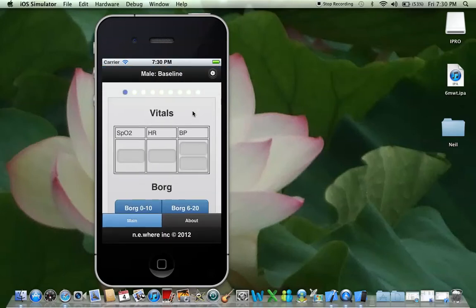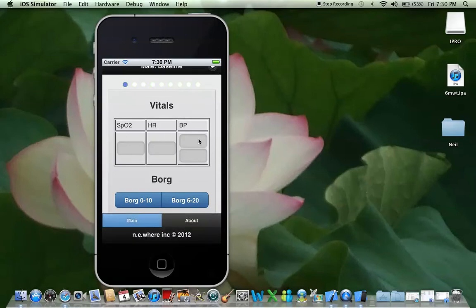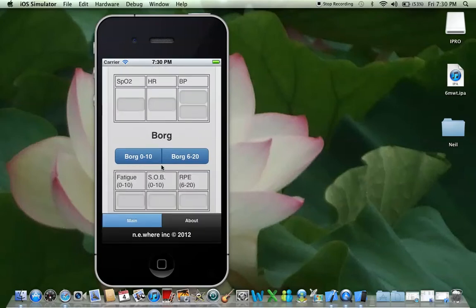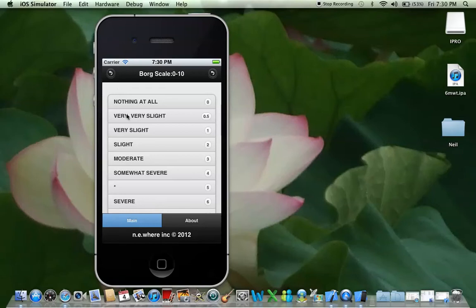These are your baseline observations: oxygen, heart rate, blood pressure, your Borg scale ratings for fatigue, shortness of breath, and rate of perceived exertion. I've got all the Borg scales included. Now, I know these back buttons look a bit funny with there being two — I'll explain that when we get to the iPad interface.